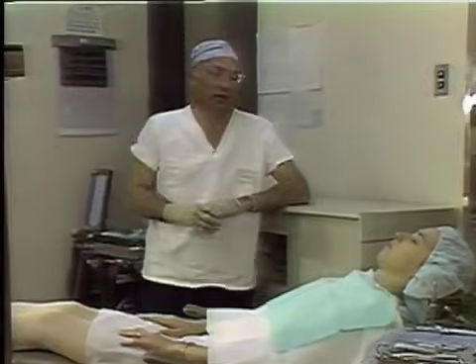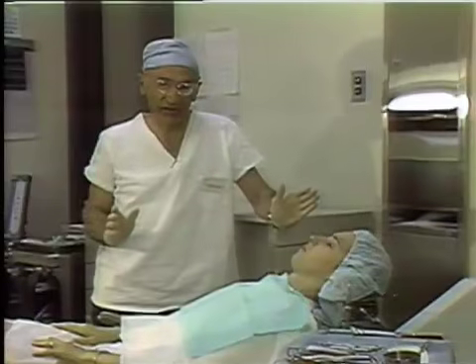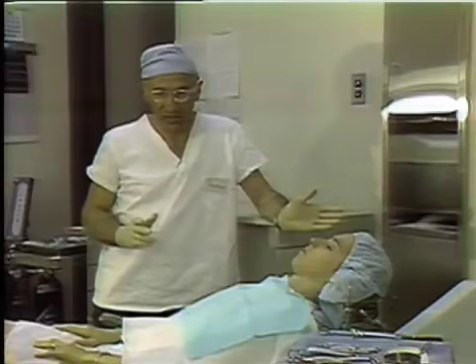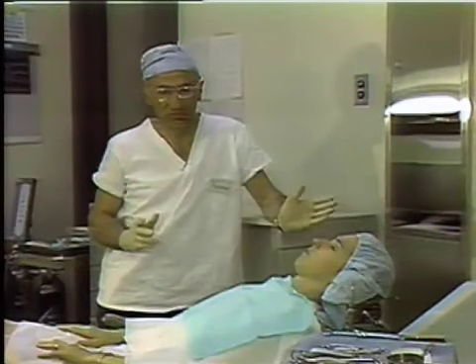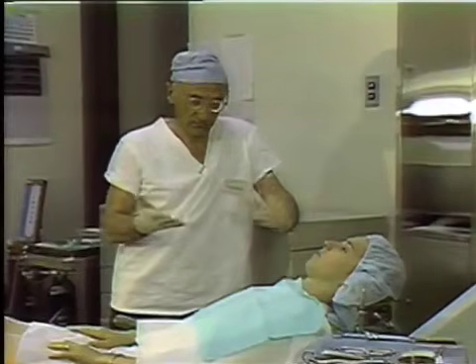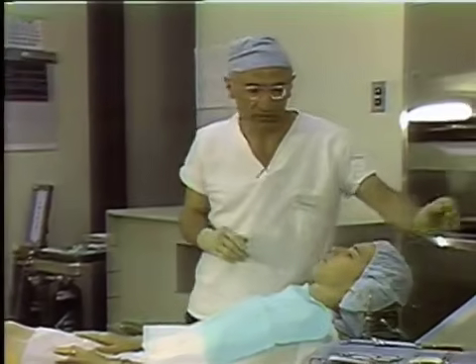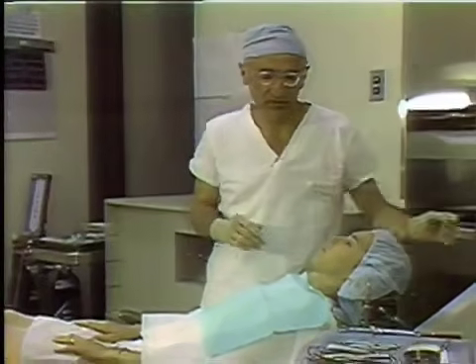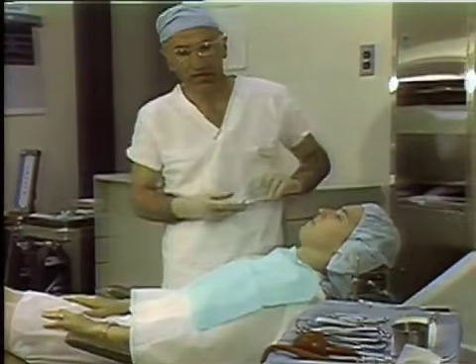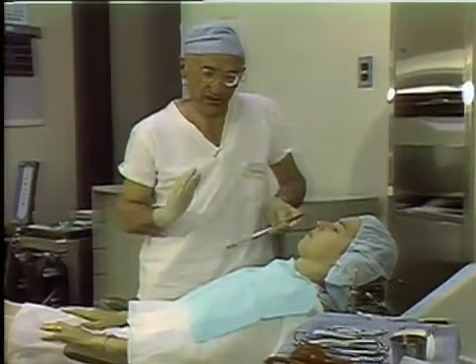We will find, again, one who is prepared, we hope now psychologically as well as physically, for what we hope to carry out. Anesthesia will be administered utilizing local anesthesia. We have, again, scrubbed so our gloved hands are clean, and we would be able to proceed with the administration of the local anesthetic. In the administration of local anesthesia and in the work that's carried out in surgery, it is well to segment the areas of procedure.